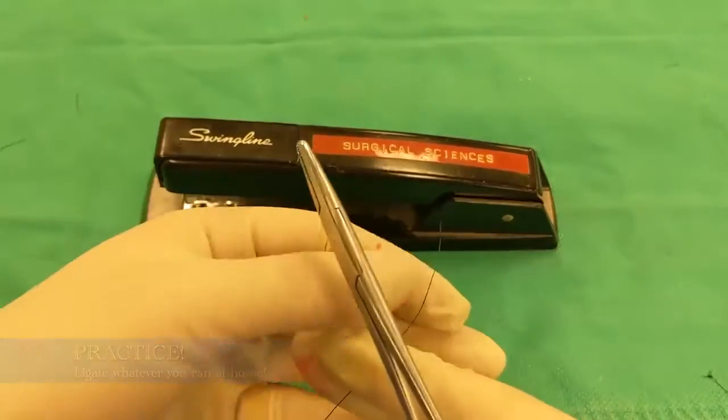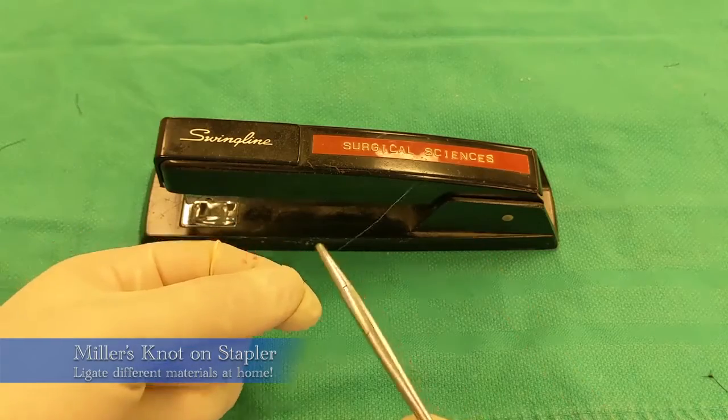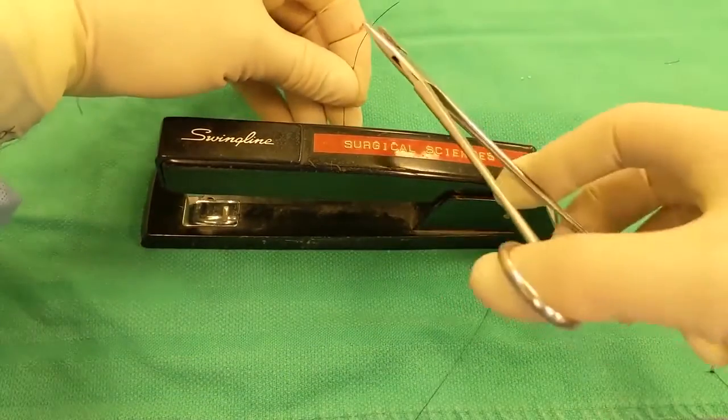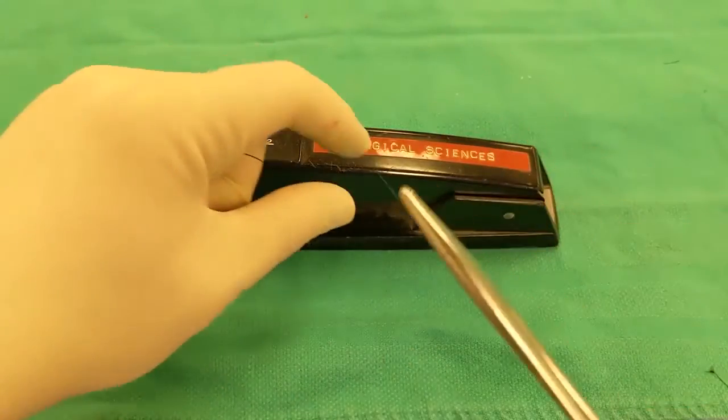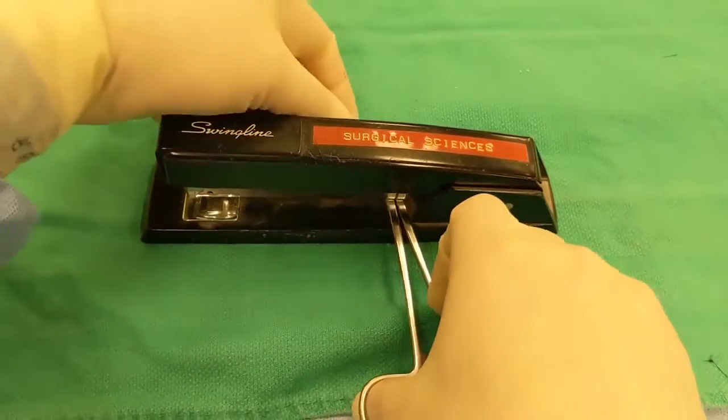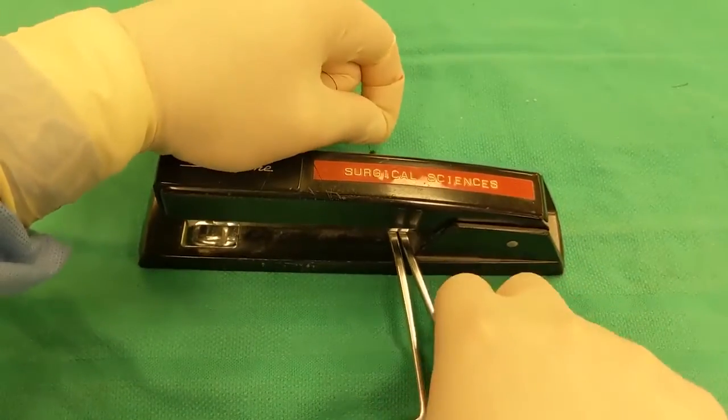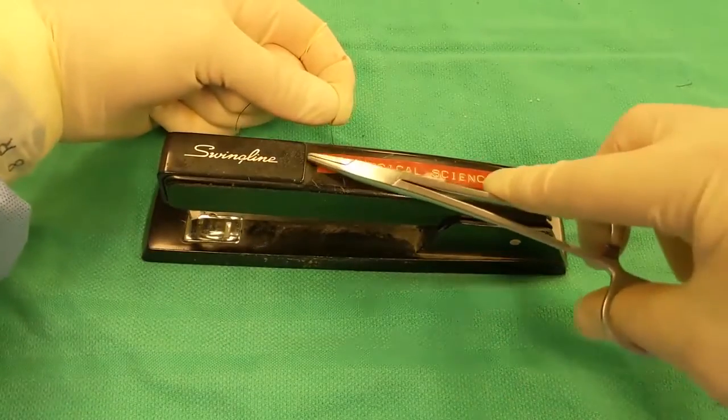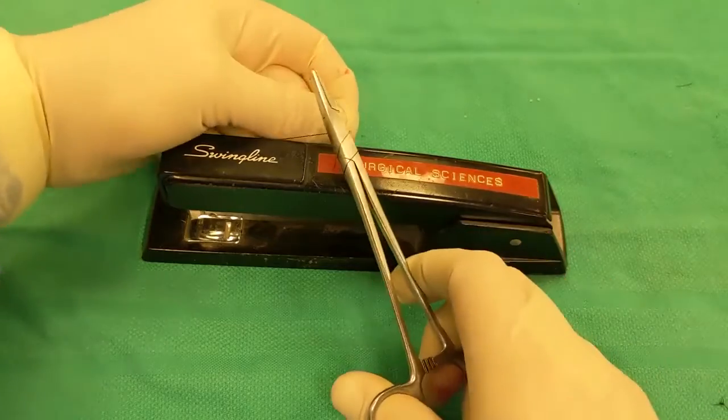It's time to practice at home. You can literally ligate anything. Here we are doing a miller's on a stapler, and ligating items, and ligating objects with different size, thickness, hardness, weight, can all be really helpful in helping you to familiarize yourself with the knot, and be able to perform them in multiple different clinical scenarios, and from multiple different angles.